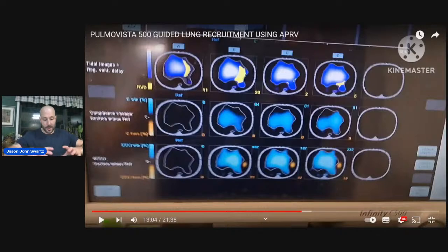So you have alveoli that are collapsed. The good alveoli that are beside those collapsed ones, on expiration, actually get yanked and distorted. You can actually have overdistension of good alveoli that are adjacent to atelectatic alveoli.